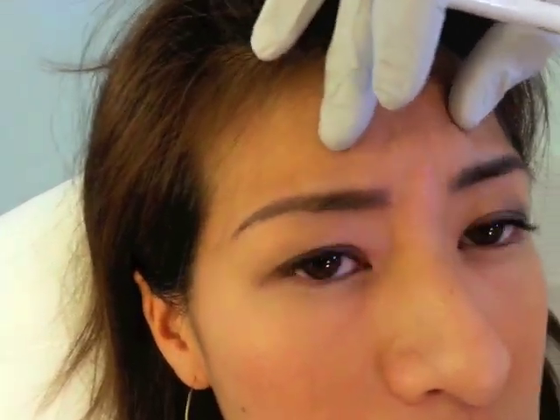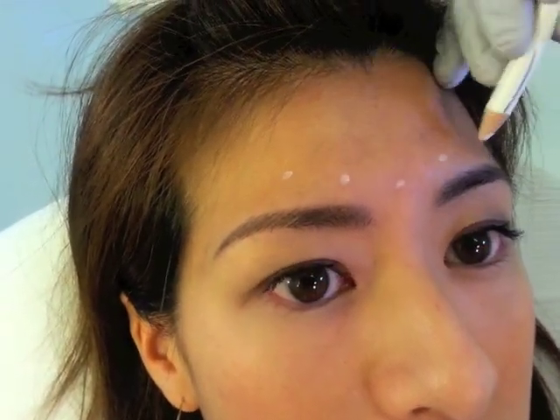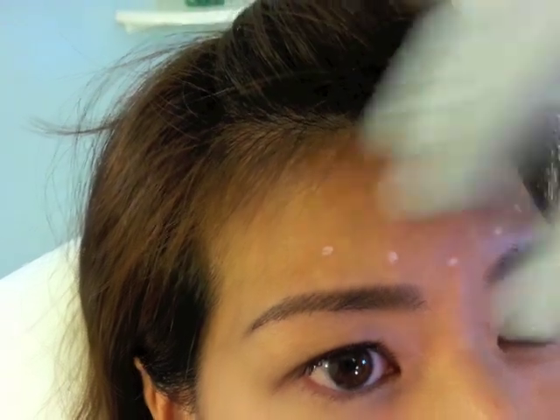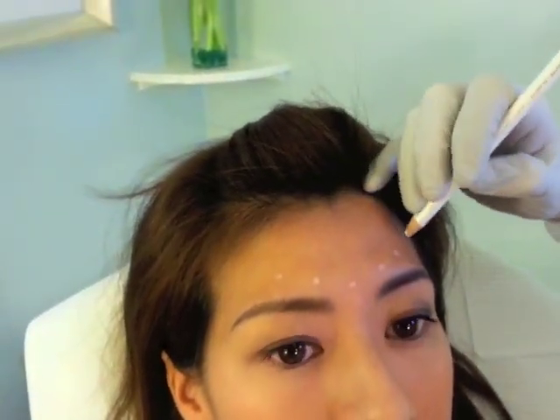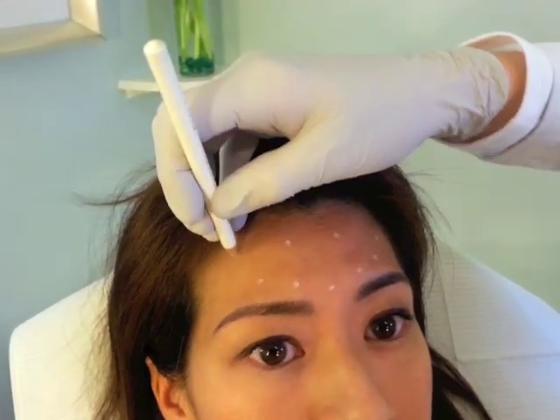If you can go ahead and make your mad face for me and then relax. I'm just going to make little marks where I'm going to do the injections. Go ahead and raise your brows all the way up for me and then relax. I'm going to do a very even amount all the way across the forehead — just enough to soften the lines but not necessarily completely stop the movement.